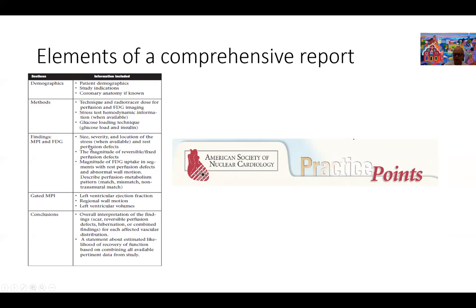Then we describe the same way we describe perfusion defects. We describe the size, the severity, and the location of the stress and rest perfusion defects. We do the same thing for reversibility, and we can then talk about match defects on the FDG, whether they match. We have a defect on rest, defect on stress, and now defect on FDG indicating scar, or whether we have a defect on the rest images that fills up with FDG indicating hibernation.